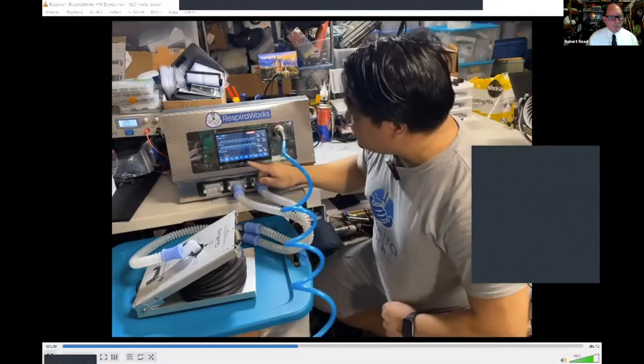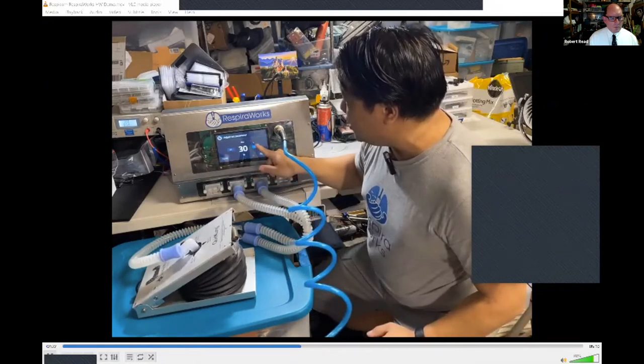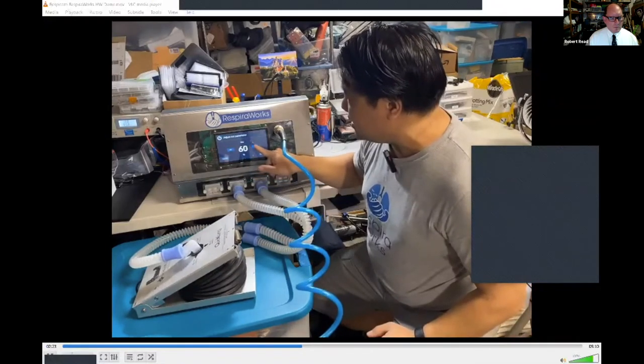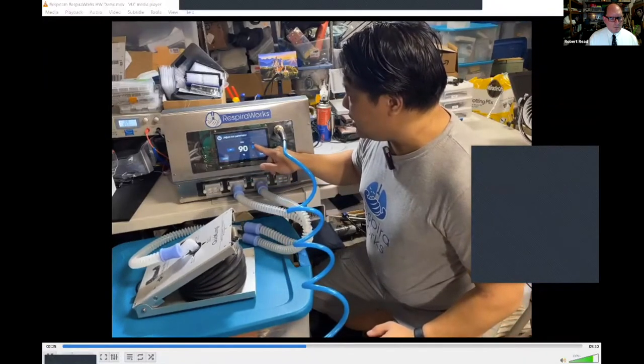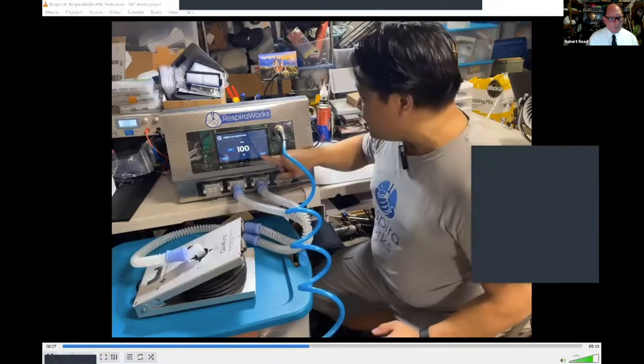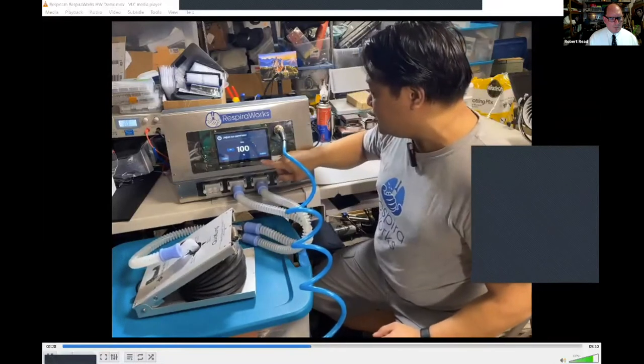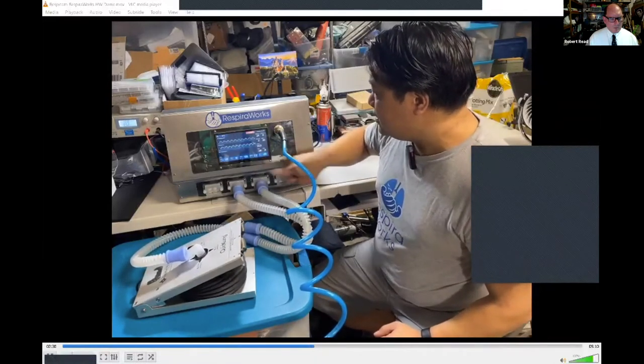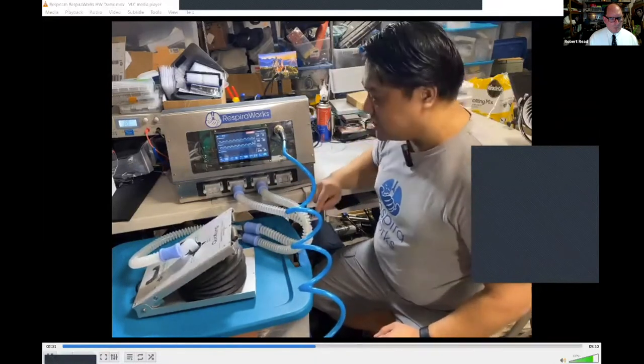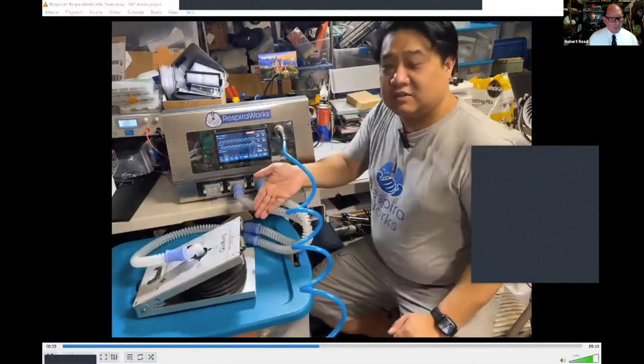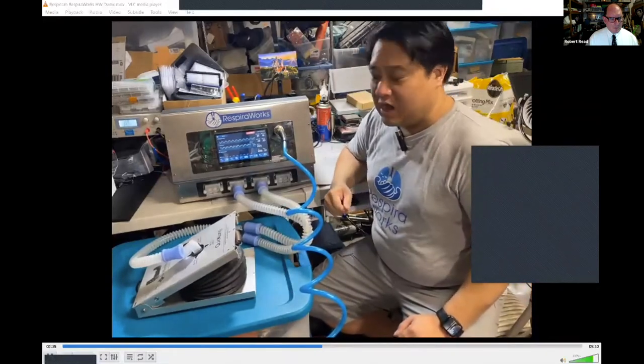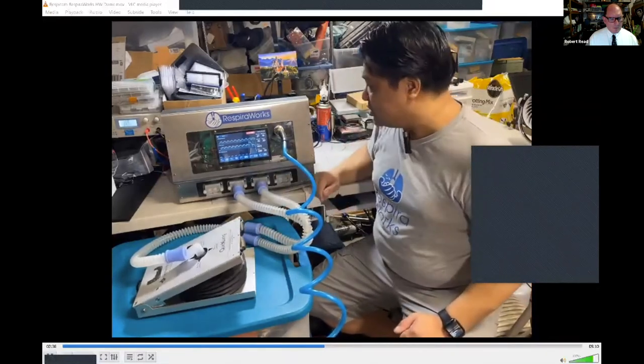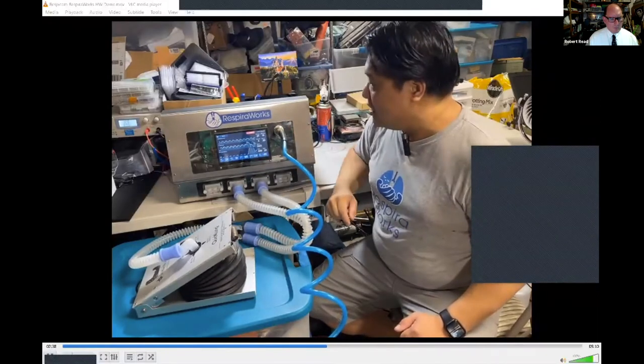And for demonstration, we're going to set the FiO2 all the way to 100% to demonstrate pure oxygen control. So you hear the blower shut down there and the vent now running, delivering to the patient off of the supplied oxygen.